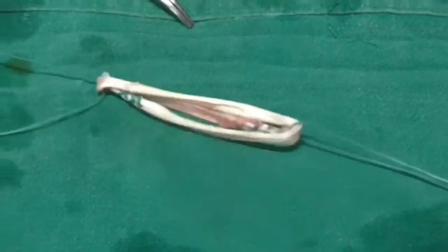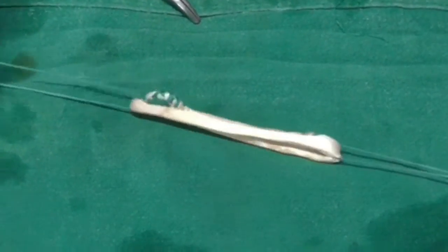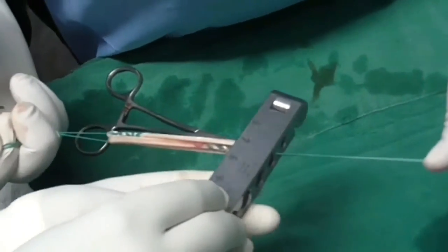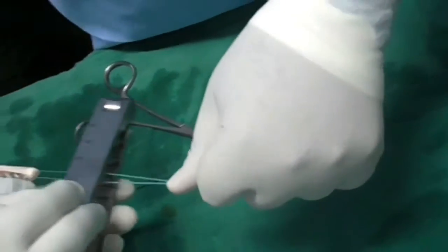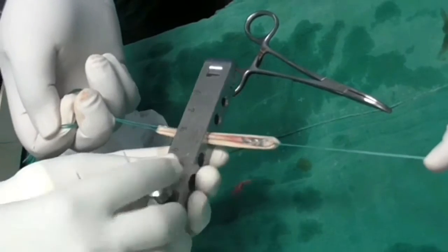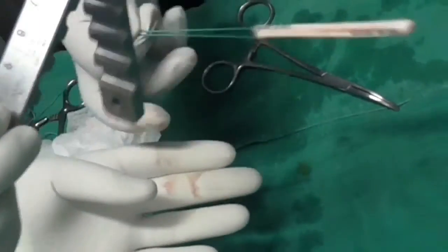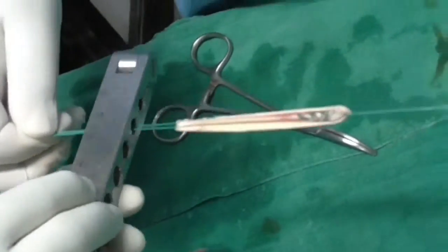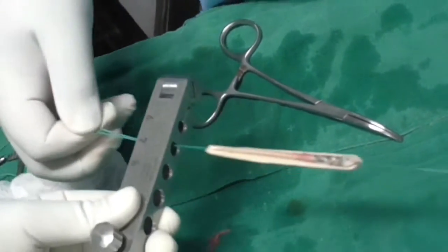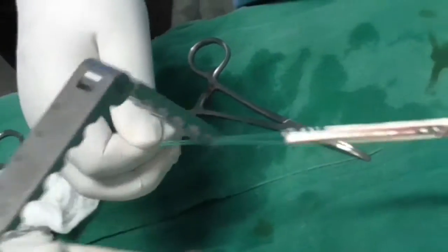Then pull both sutures from both sides apart so the graft is triplicated. This is a very simple technique of triplicating the graft — you can see it's very tight. An important thing to notice is that the sides of the graft may not be equal. Here you can see one side is 8mm and the other side is 7mm, so we have to be very careful.